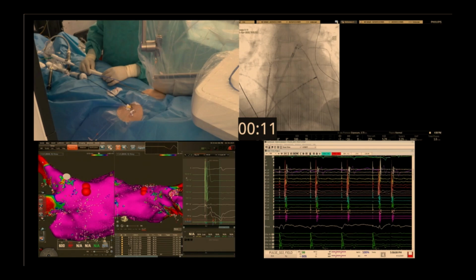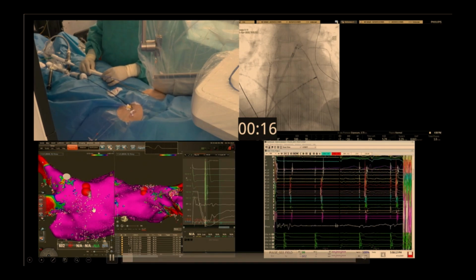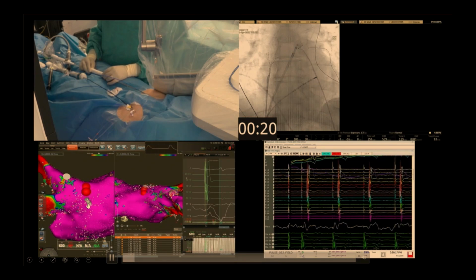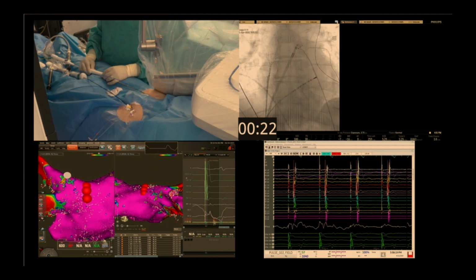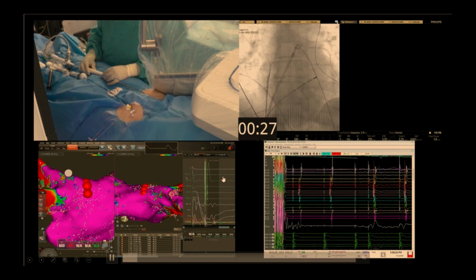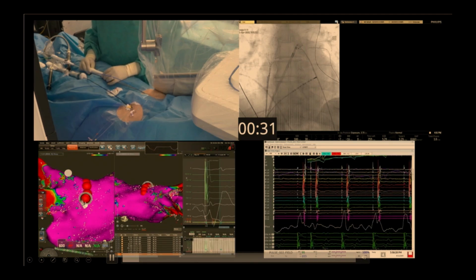So we're clicking. We identify a point where we think the catheter is sitting. So, for example, there's the catheter. Bring it down here, and then you see that we take a point, deliver the pulse. You just see that flying past really quickly. Then move to the next location, etc.